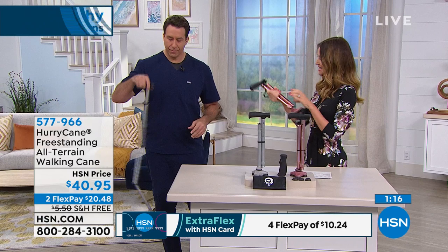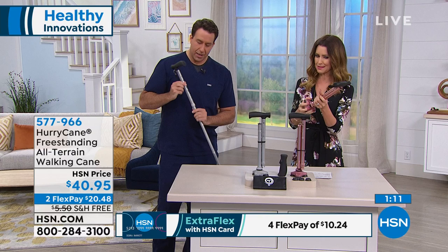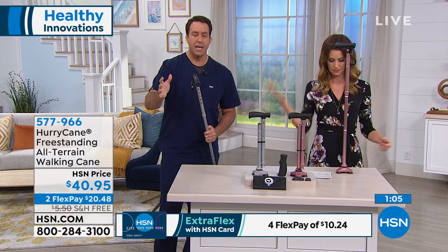And you're so stable — up to 350 pounds it supports. That's amazing. You know, 'stably' is a word to me because what it conjures up in my mind is safety. We want you to be safe; everybody wants you to be safe.